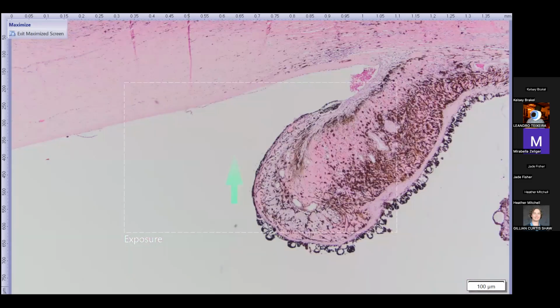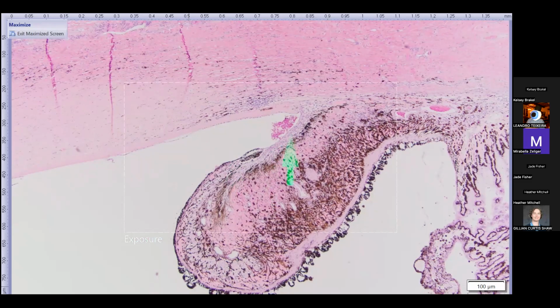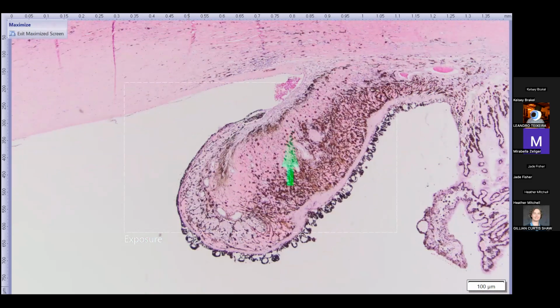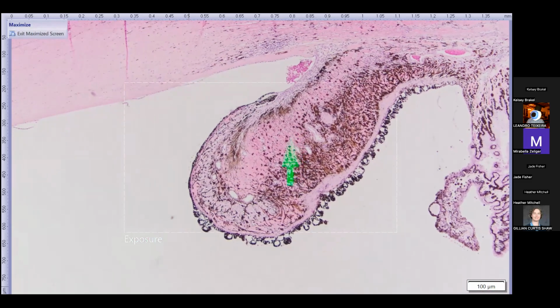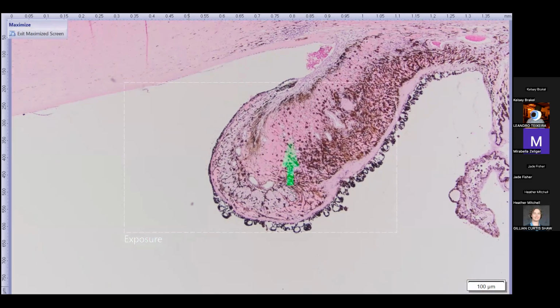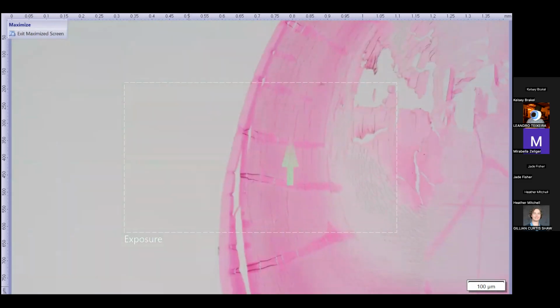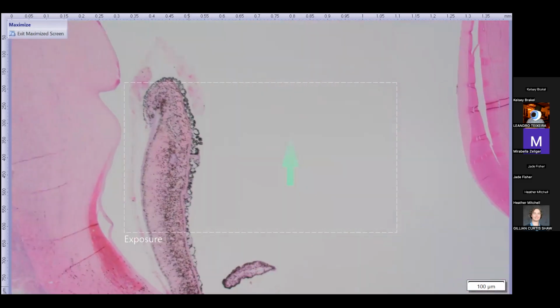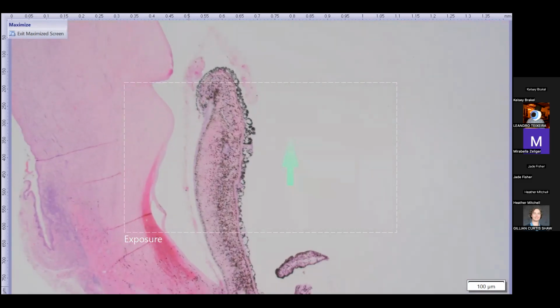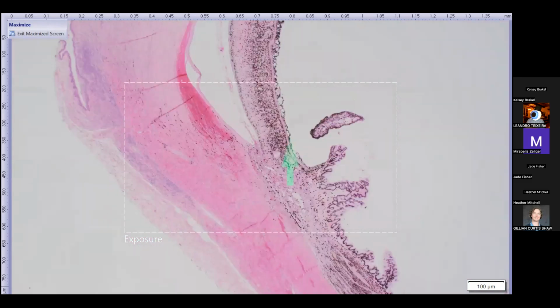Looking back at the iris here, there's a thick pre-iridal fibrovascular membrane that lines the front there and causes quite the ectropion uvea. So the tip of the iris leaflet is being pulled forward anteriorly into the anterior chamber. And here we can see it on the other side, where it's just the tip being pulled forward. There's some hemorrhage here at the peripheral cornea.